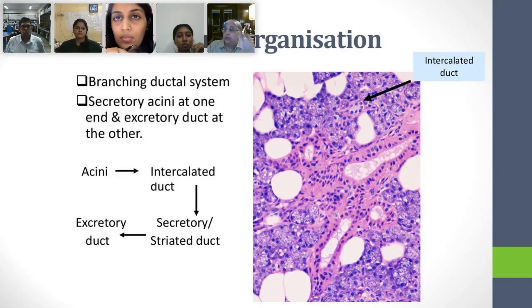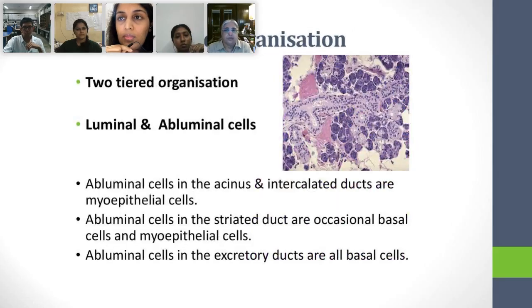Will anybody tell me which salivary gland this is likely to be? Is it a major gland or a minor gland? Major. Parotid. It's the parotid. Why is it the parotid? Because of serous acini. Because it's predominantly all serous. That's excellent. So now tell me which gland this is, and then we will just quickly describe what is going on.